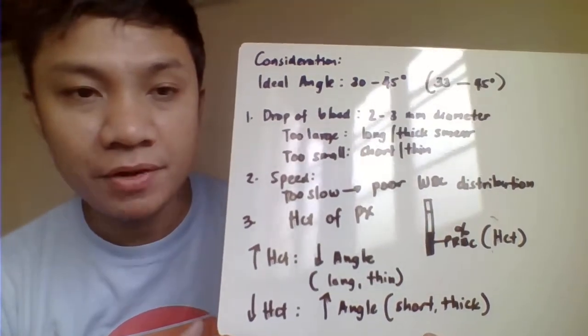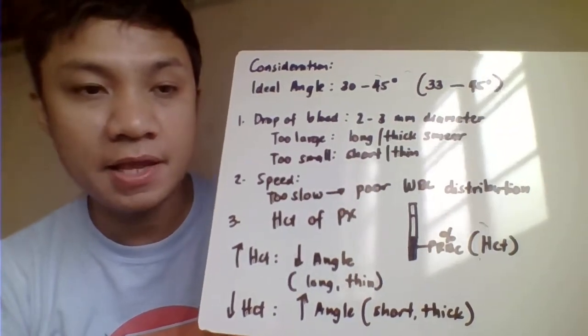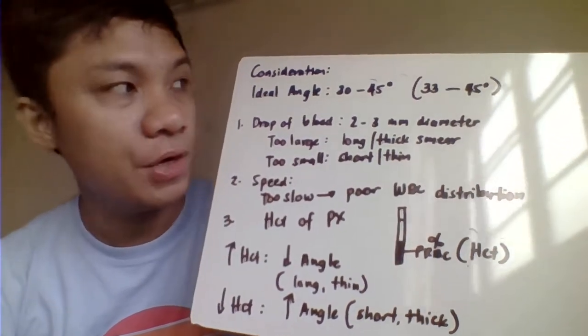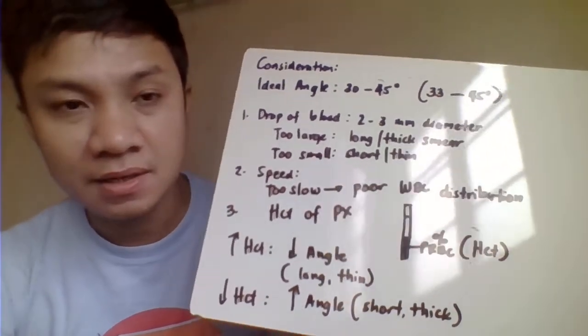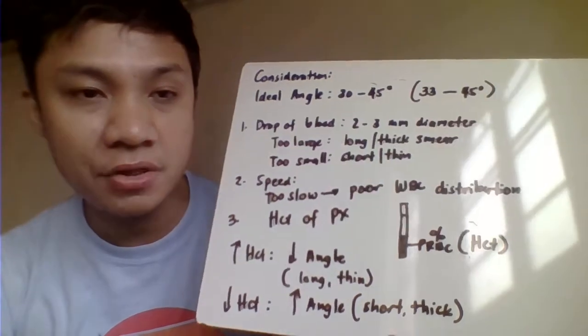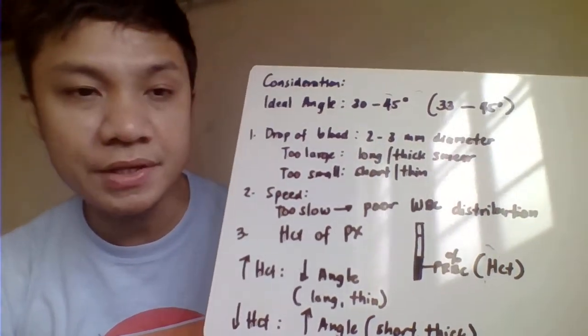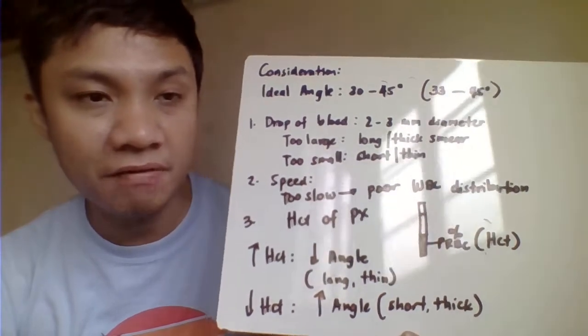Okay, so we also have here the ideal angle when you are making a smear. Approximately, we have here 30 to 45 degrees. In some references, you could have 33 to 45 degrees. Okay, then we have considerations when you are making your film or smear.